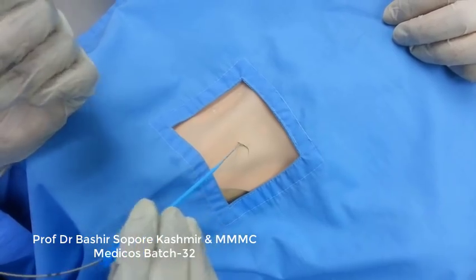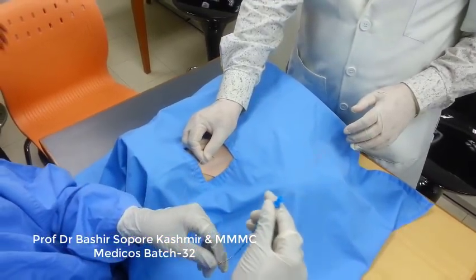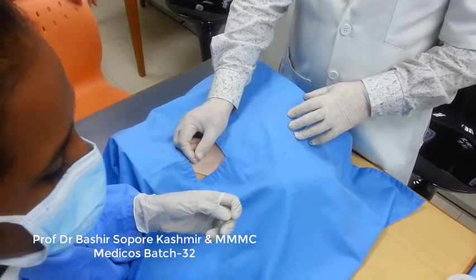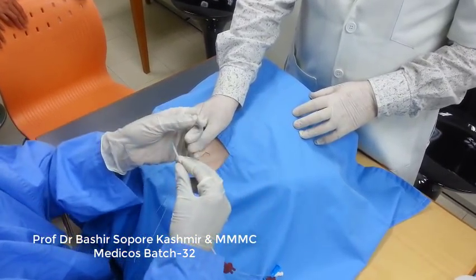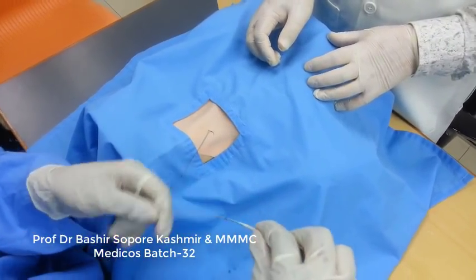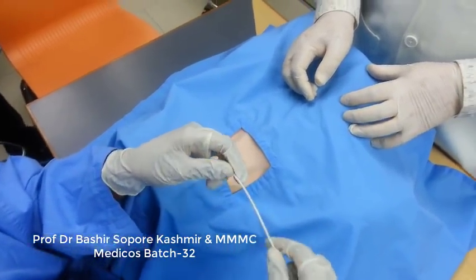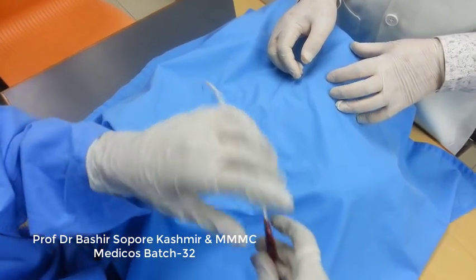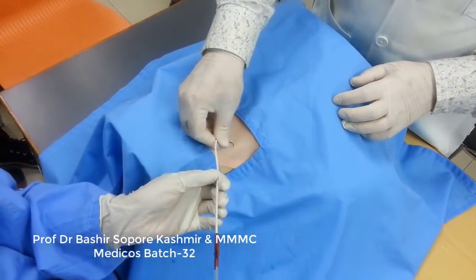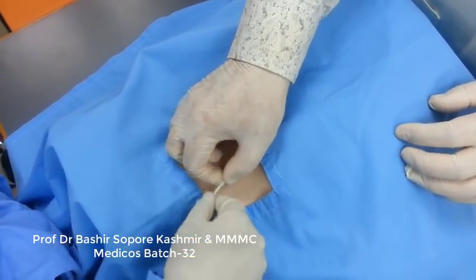So once it is dilated, you take out the dilator, then you slide the catheter, Seldinger catheter or 2-lumen catheter. We have multiple lumen catheters: 3-lumen, 2-lumen, 1-lumen, isn't it? And you slide it over the guide wire. From the other end the guide wire has come, and you introduce the catheter straight over it. Okay, so it is going very freely.